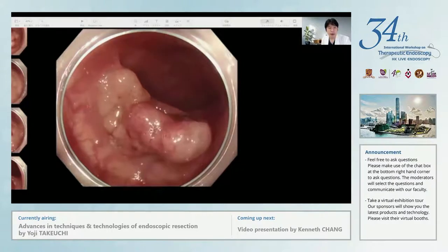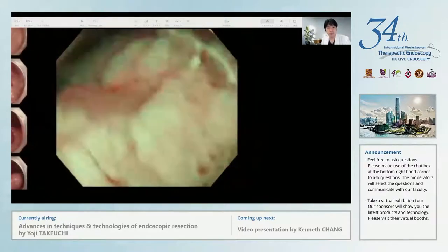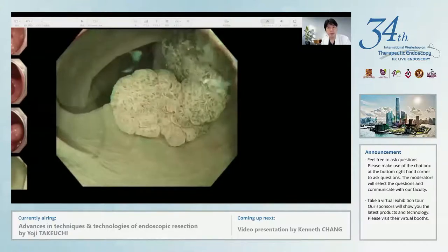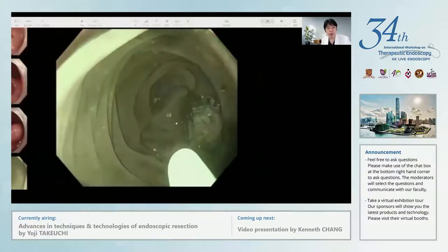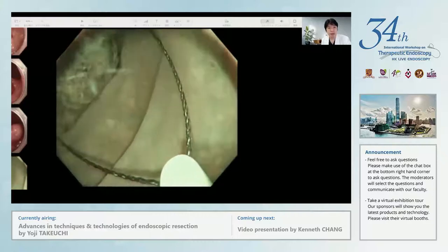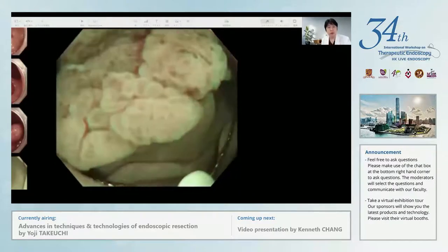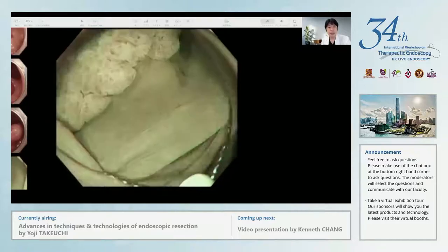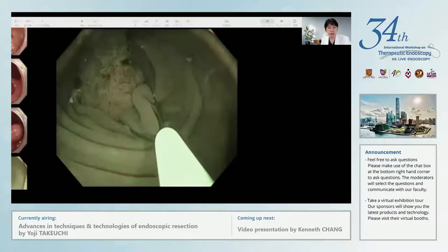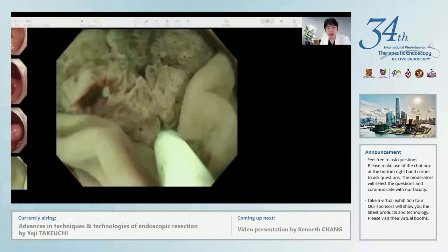Here, let me show you the movie of my underwater EMR. You can see about a 25mm sized protruding polyp in the sigmoid colon. When I perform underwater EMR, I prefer to observe it with narrow band imaging because it shows the polyp boundary more clearly. After enough insufflation of water, I snared the lesion without any submucosal injection. As you can see, the polyp looks floating under the water, and it is easy to snare the polyp including the surrounding normal mucosa. The risk of perforation with underwater EMR is quite low, even without submucosal injection.